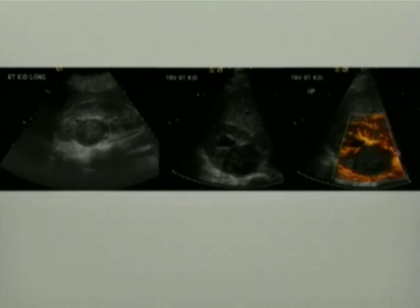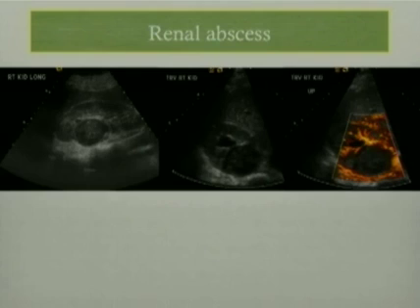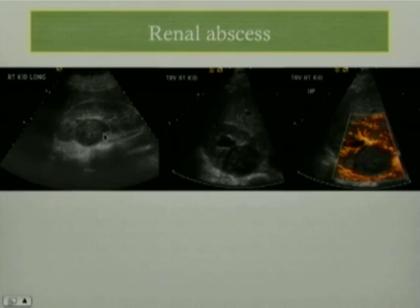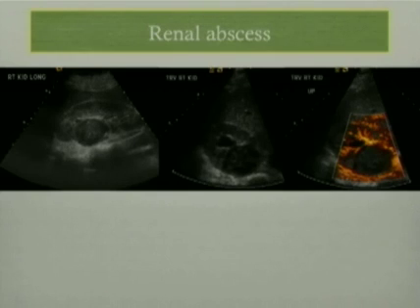Another right upper quadrant pain cause is that of a renal abscess or pyelonephritis. Pyelonephritis usually can be a difficult diagnosis on ultrasound; however, when it forms a renal abscess, it is usually better seen on ultrasound — as seen in this ultrasound image as a focal hypoechoic area within the renal parenchyma with increased peripheral vascularity.